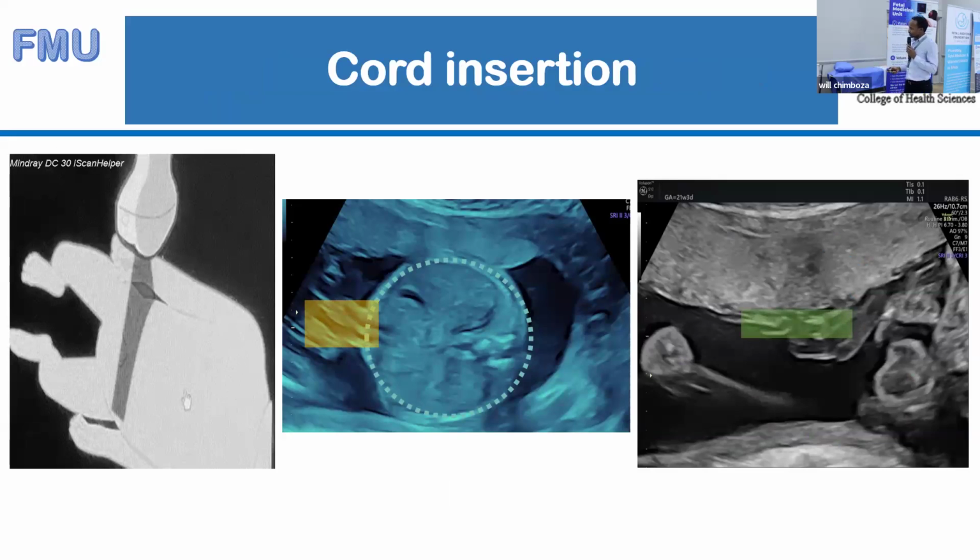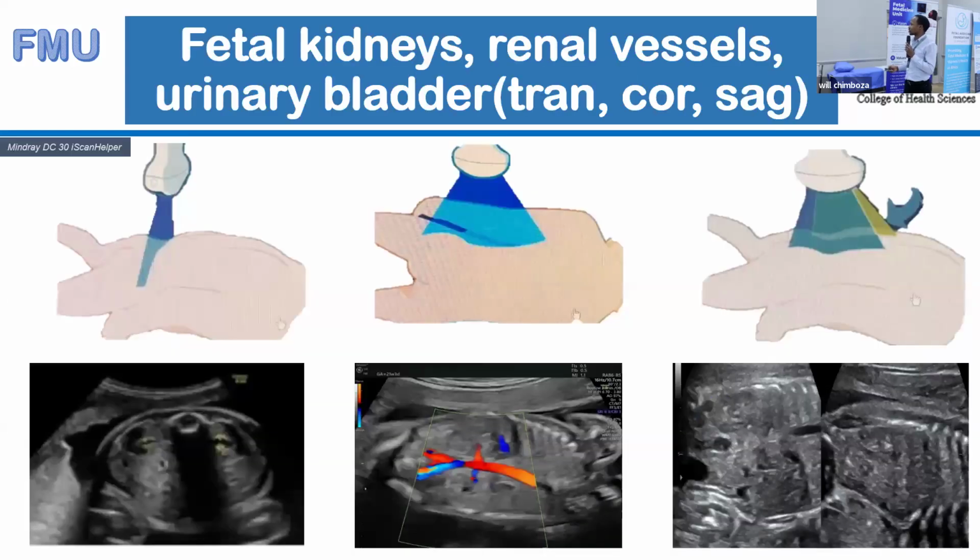From this view again, still in that orientation, we move distally towards the fetal bladder.